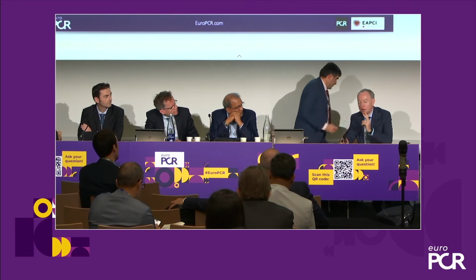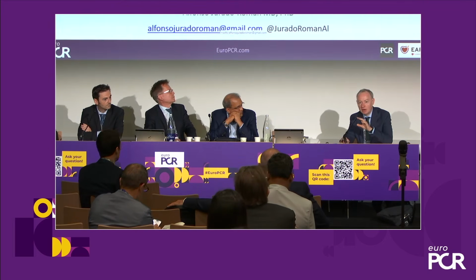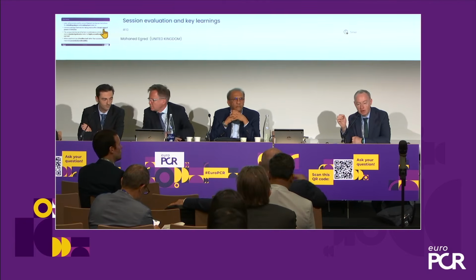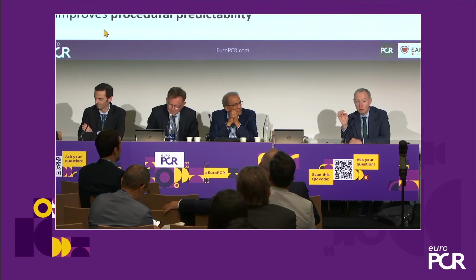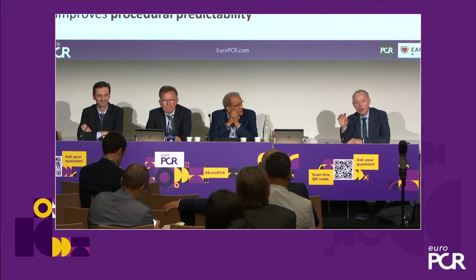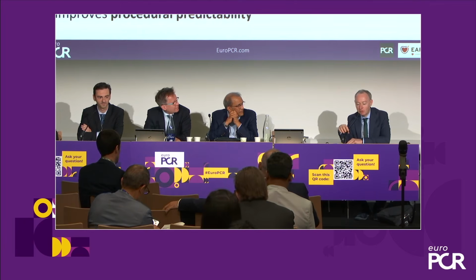I'll just make two comments, particularly about saline. For 90% of the cases you're going to be using saline, and that keeps it safe. I think contrast will change, particularly with an under-expanded stent. You need the amplification. James has done some great experiments, and he's given us that information about how many atmospheres you can get to, which is fascinating. And I agree, we need to adapt this technique. But for you out there who are learning the technique, stick with saline. Advanced users can use the contrast mix.